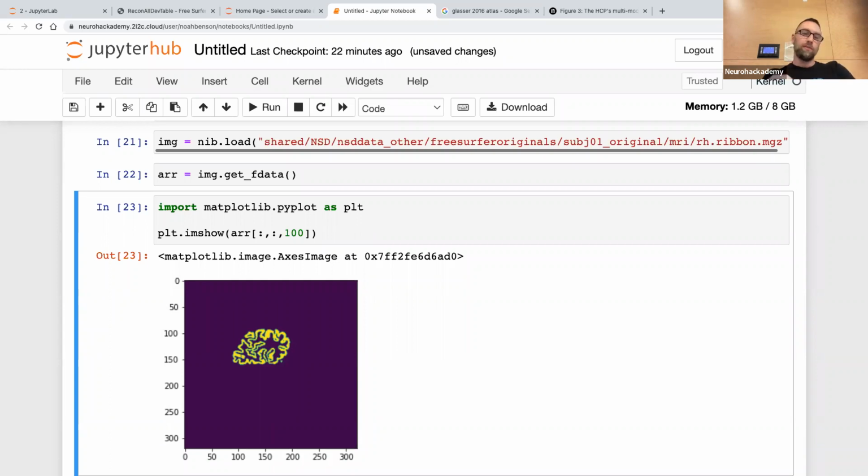Typically, if you've done some pre-processing that pulls all of the functional voxels that are in the gray matter out of your functional scan, what it's done is figured out, based on the ribbon.mgz in the FreeSurfer files, which voxels are in the gray matter, and then it's pulled those voxels out. That's often how those operators work.